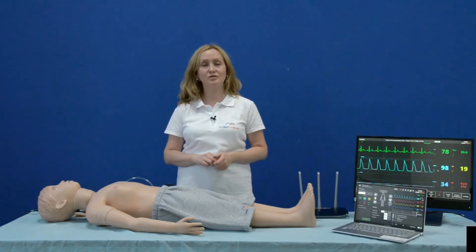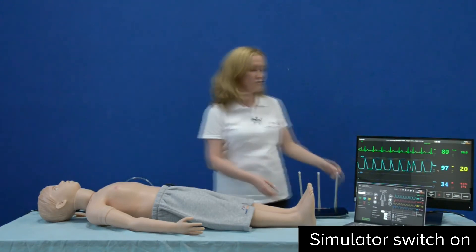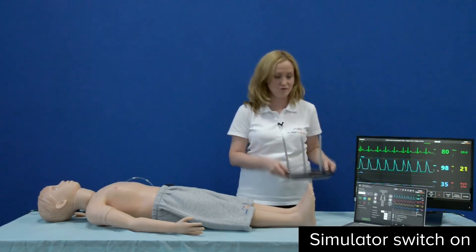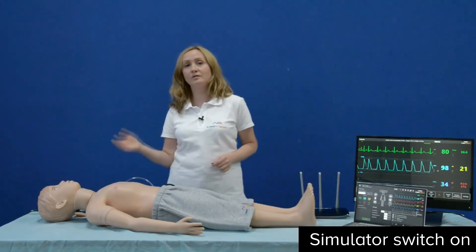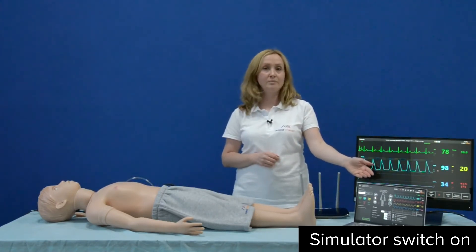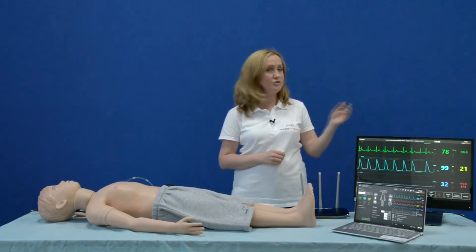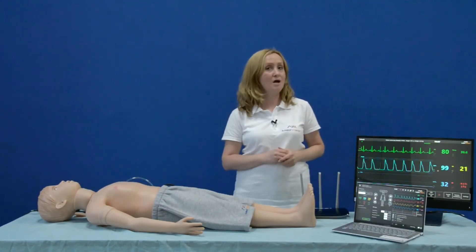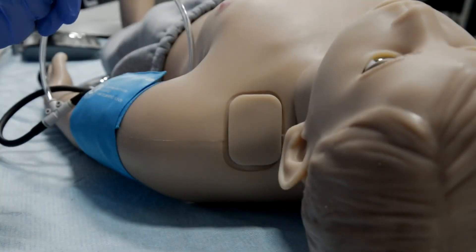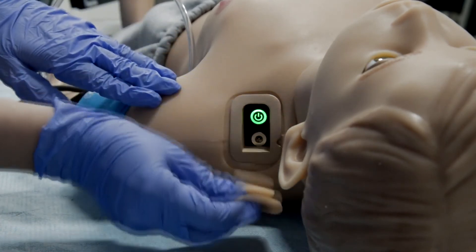Now I would like to tell you what to do to start operating the Arthur patient simulator. Step one: plug in and switch on the external Wi-Fi router, which can be located anywhere in the simulation room. Step two: turn on the patient simulator using the switch button. Step three: turn on your laptop or tablet PC, which will run the instructor software automatically, and then start the patient monitor imitator, which is optional. You will find the switch button on the left shoulder of the Arthur patient simulator — just remove the silicone tab and you will see it.